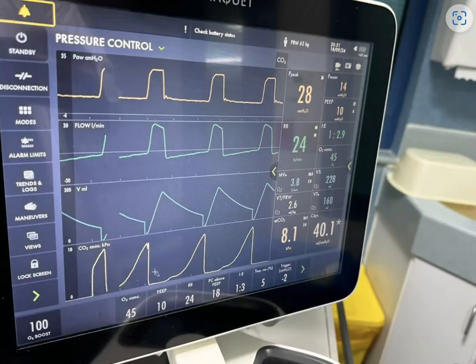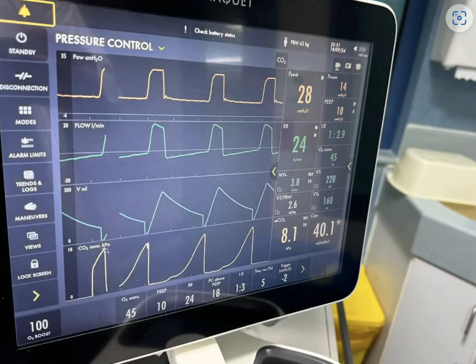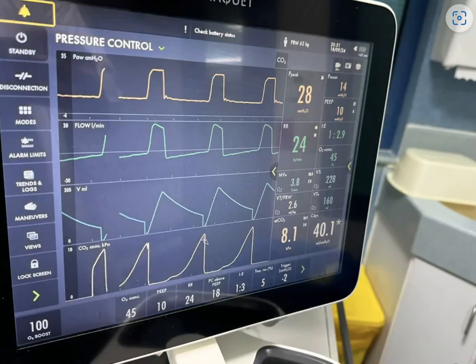Now take a look at the CO2 monitor. Compare this breath with the initial breath, where the CO2 rises initially rapidly and then slowly to the peak or end-tidal level, and then inspiration starts. Compare this with the rise here — you can see a very slow rise in the CO2 level, yet the end-tidal level remains the same.